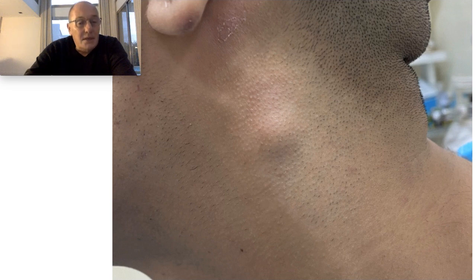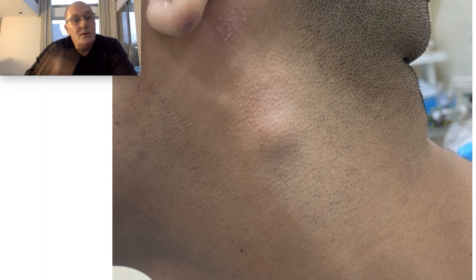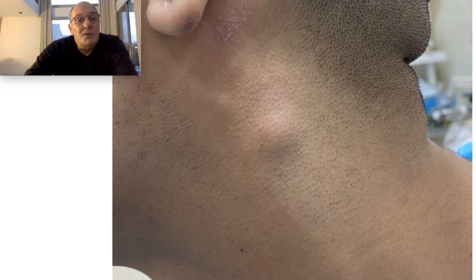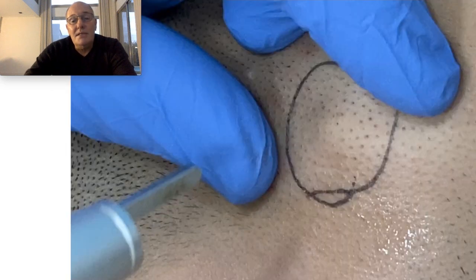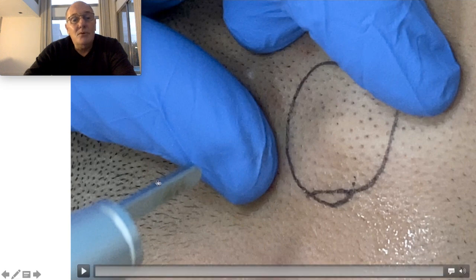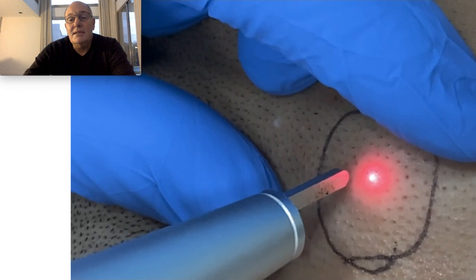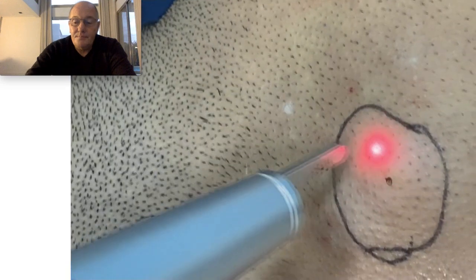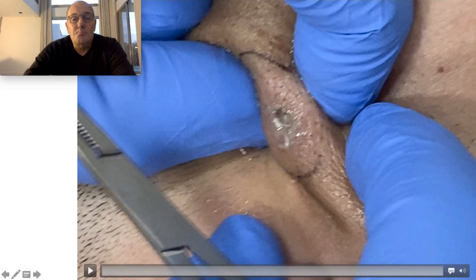I have dedicated several years to patient education. I think it is important to develop new techniques, but also very important to let patients know about these new procedures. Here we have the cyst, and this is a carbon dioxide laser used in the cutting way. Here we can see how the laser incision is performed after local anesthesia.